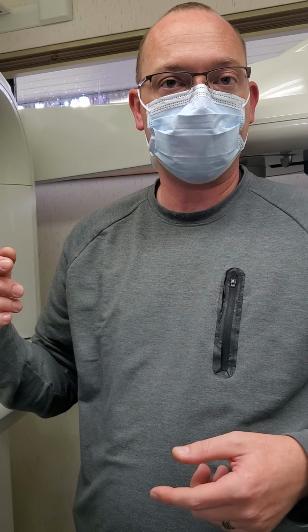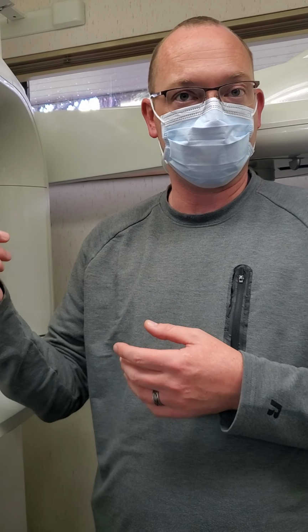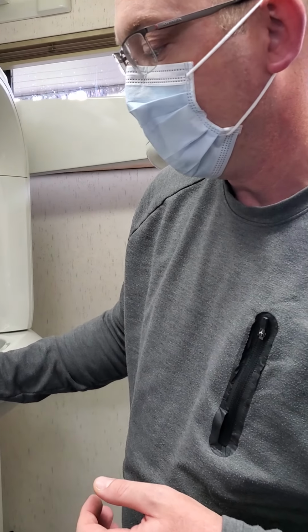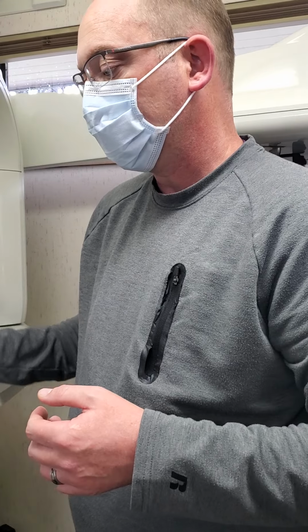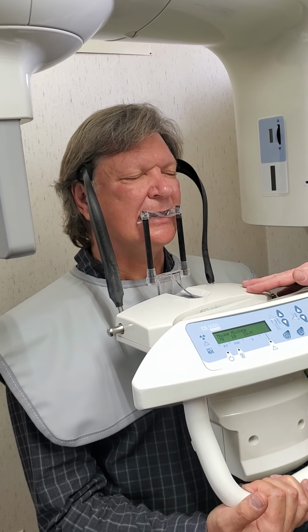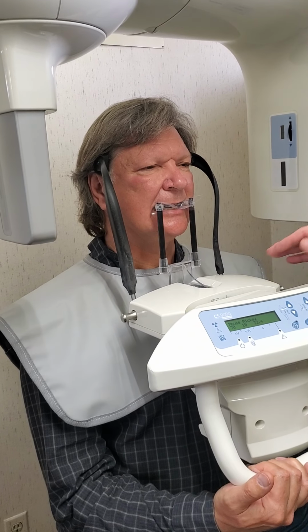It's going to reposition itself for the next pass. You push the hand switch. It does its next pass. It'll tell you to release. It will reposition itself and then tell you to press the hand switch again. Okay? So now everything's set up. All we have to do now is just follow the program. That's it.